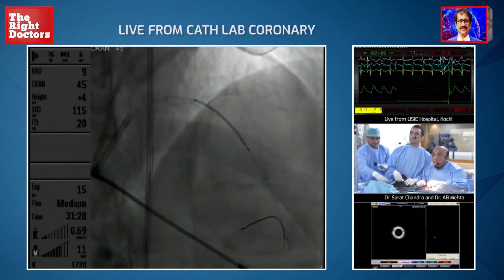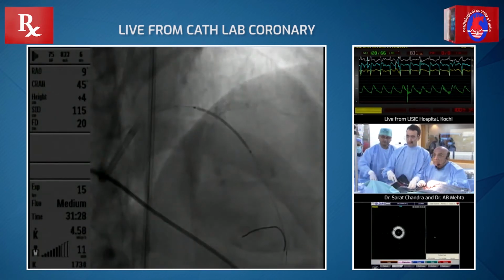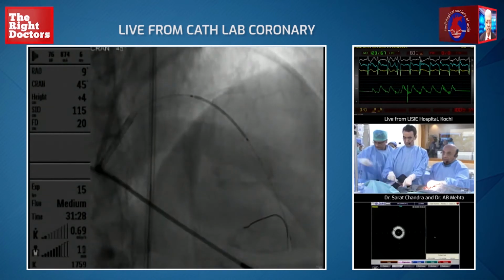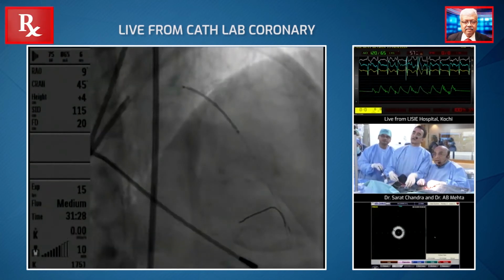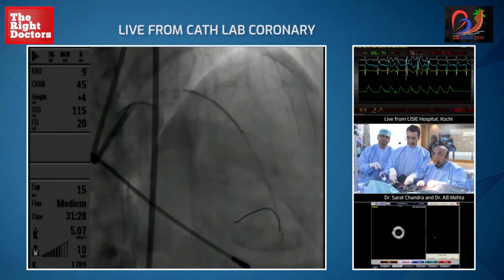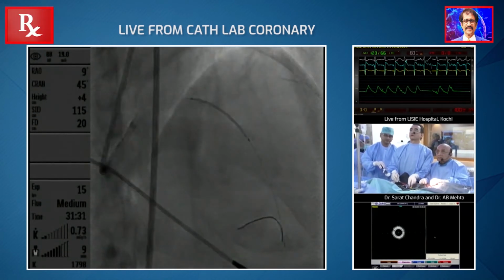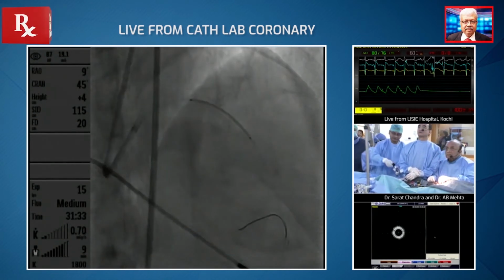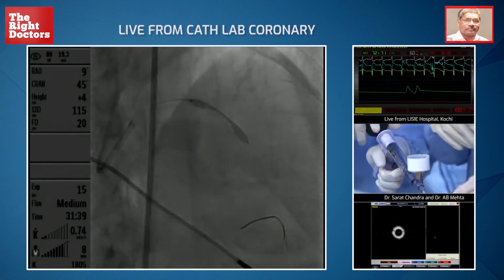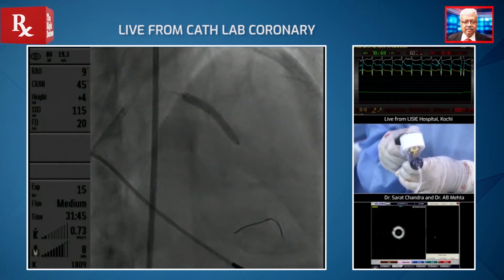That's a straightforward way of taking something like this. Just show. Yeah, 1 second. Hello? Okay. Deploy. Sir, I think we check it again. It's moving, that's okay, don't worry. Go ahead. Okay. Yeah, go ahead. You already gone. Okay. Yeah, 7, 8, 9, 10, 11, 12, yeah. 13, 14, 15, 16. Negative.